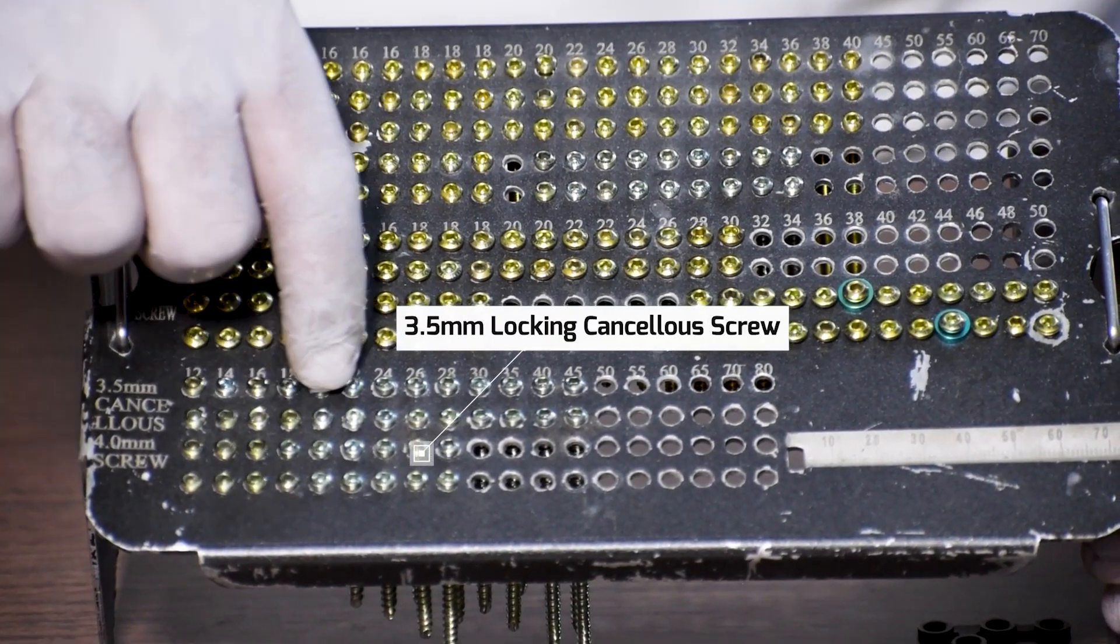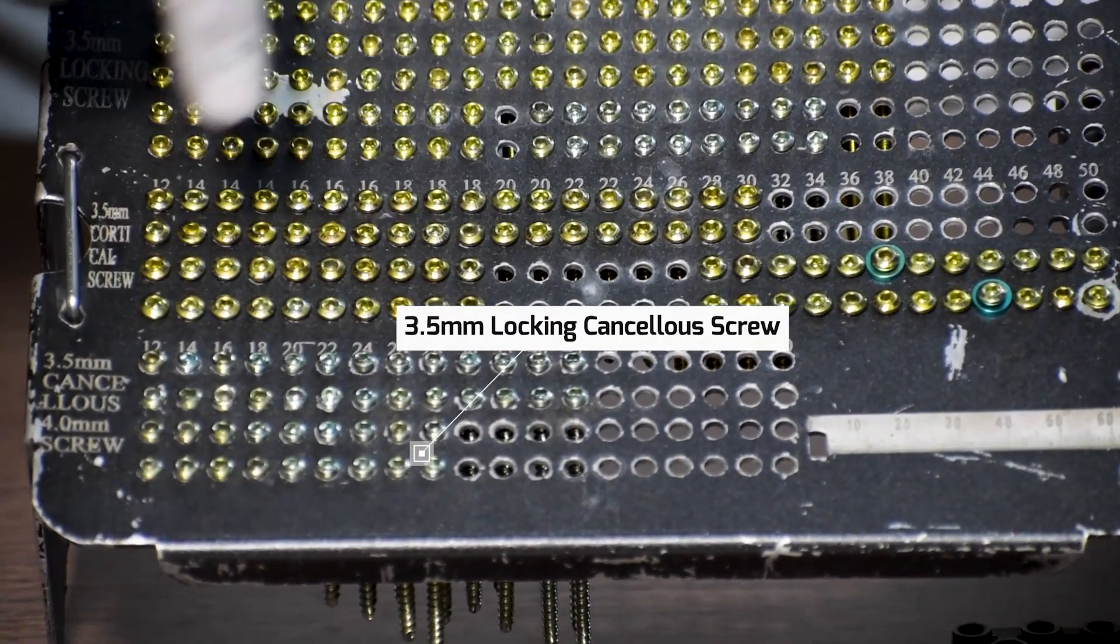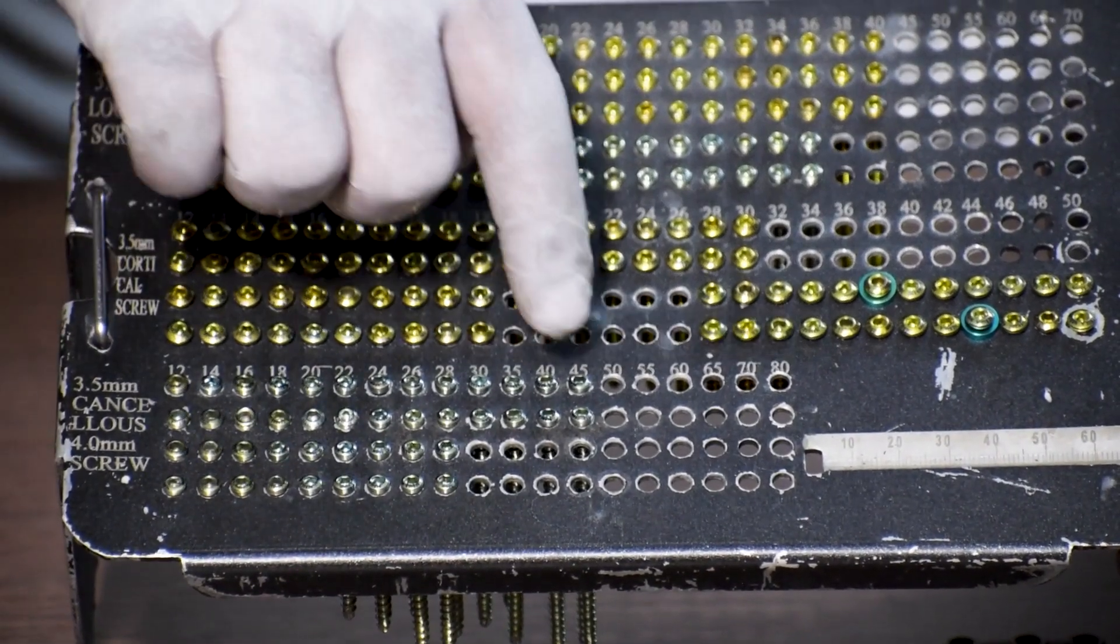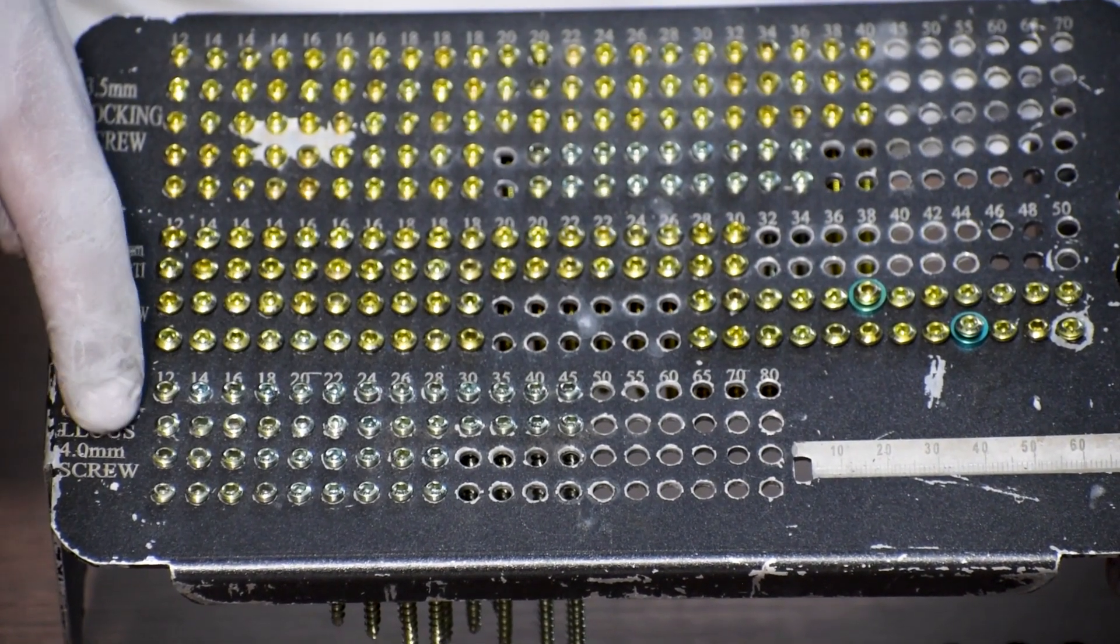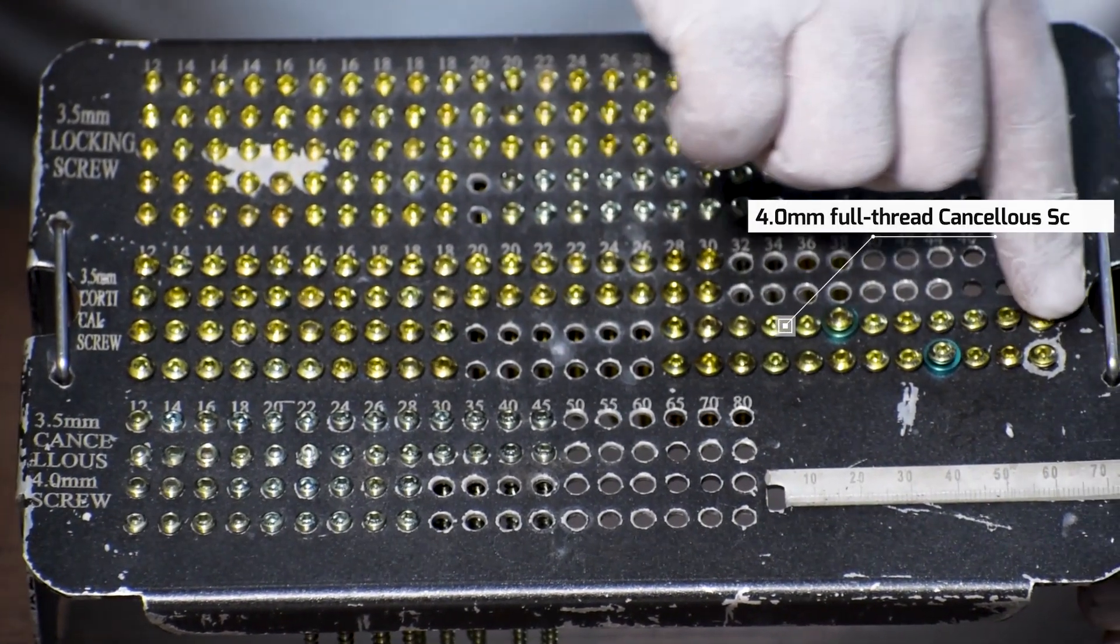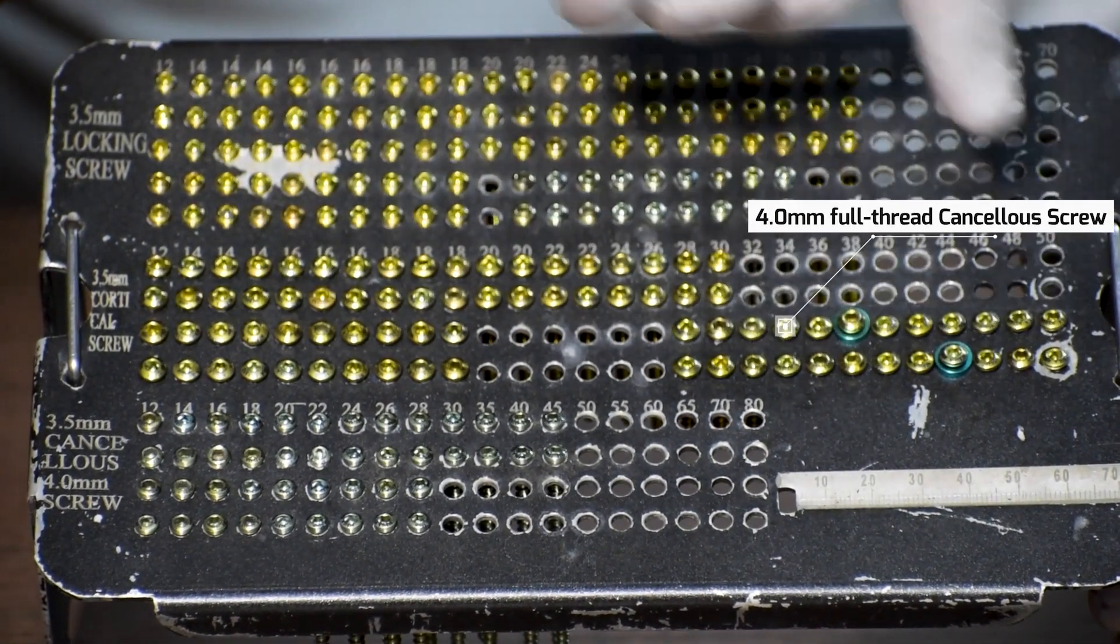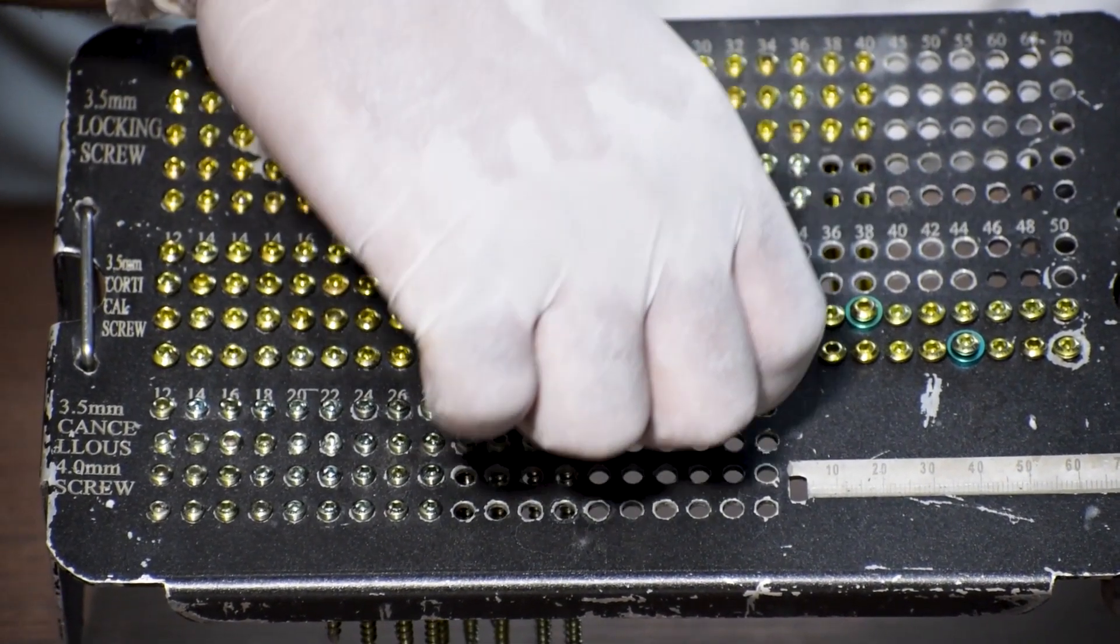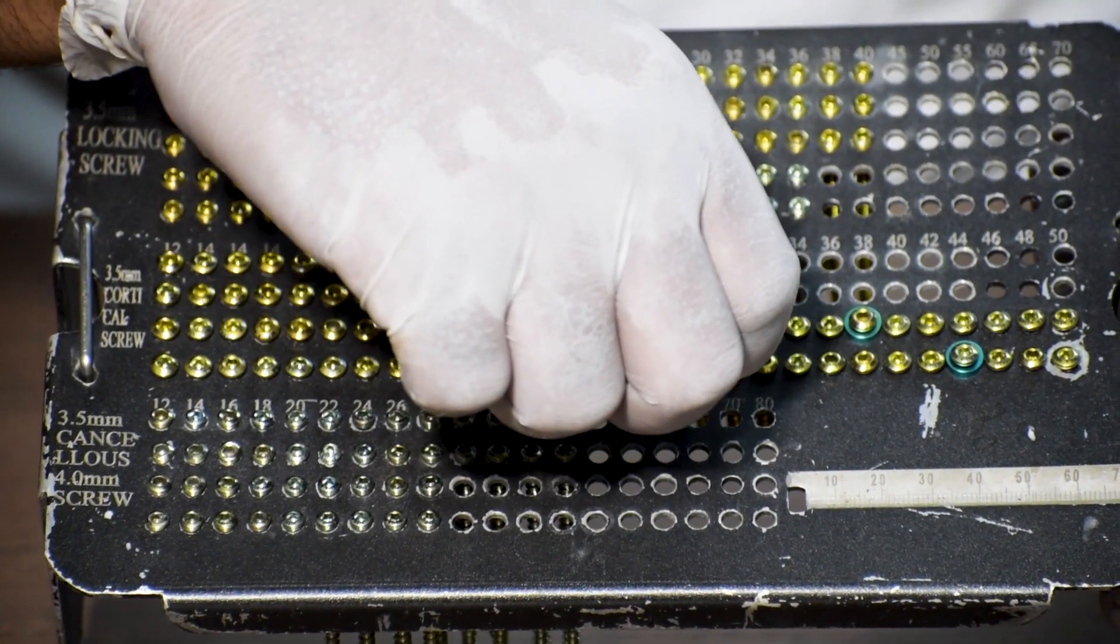These are 3.5 mm locking cancellous screws which is provided from 12 mm to 45 mm and this is 4 mm full-thread cancellous screws. This is also provided from 12 mm to 60 mm.